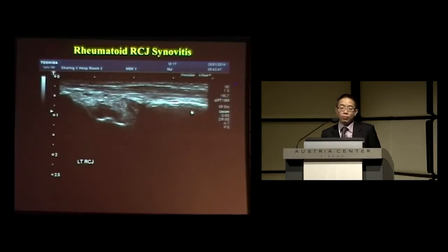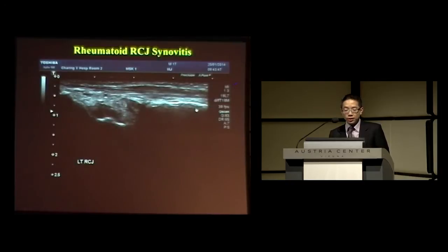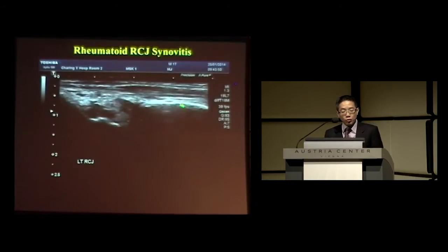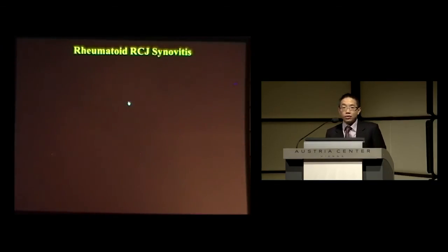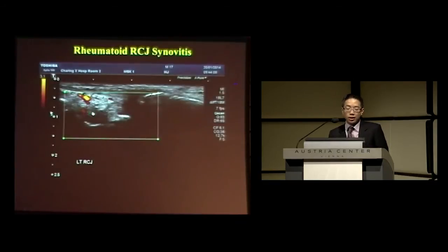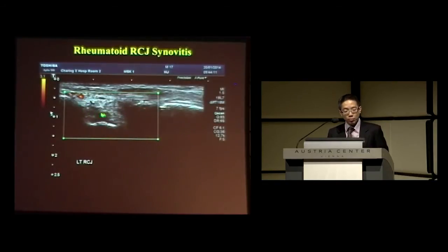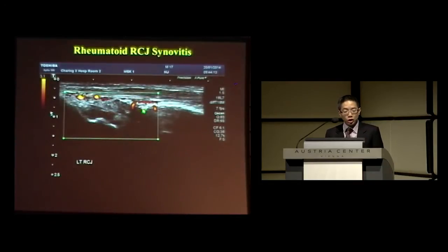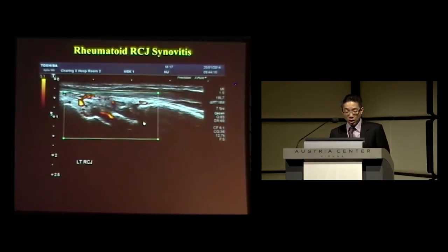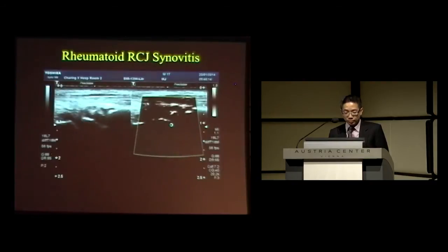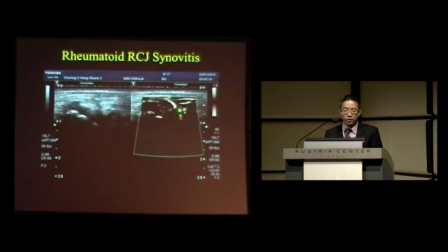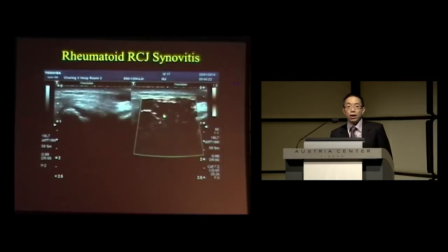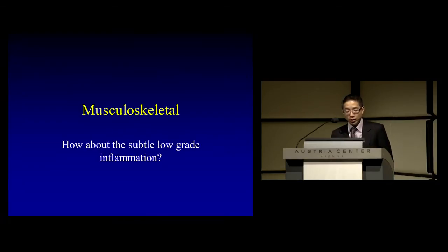Here's another example of a patient with rheumatoid arthritis. This is the extensor surface — the extensor tendon. On the B-mode image, you can already see irregularity to the distal radius and some synovial hypertrophy. When you turn on Power Doppler, you get an appreciation that there are some vessels flowing into this inflamed area. But this becomes much more apparent when you turn on SMI — you can actually see a vessel diving in, and this branching network pattern is appreciated much better with SMI.